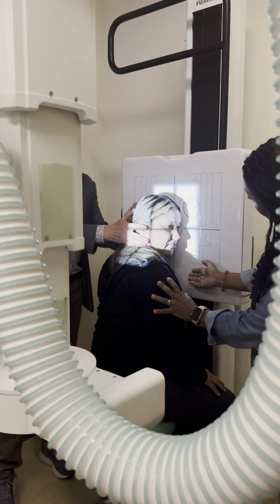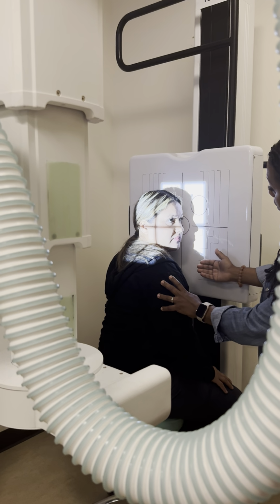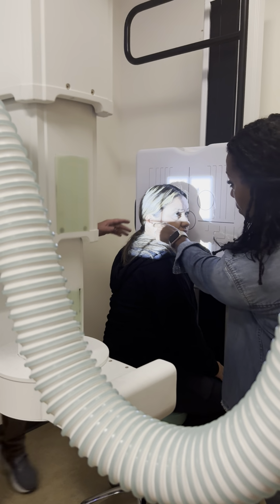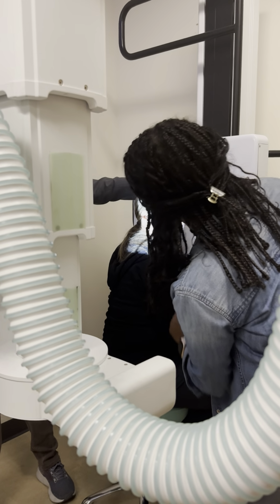We're just saying to make sure she's mid-sagittally set up, right? So what we don't want the patient to do is tilt her chin left or right to step off the mid-sagittal plane. She just drops her face. See that? Okay, I got it.